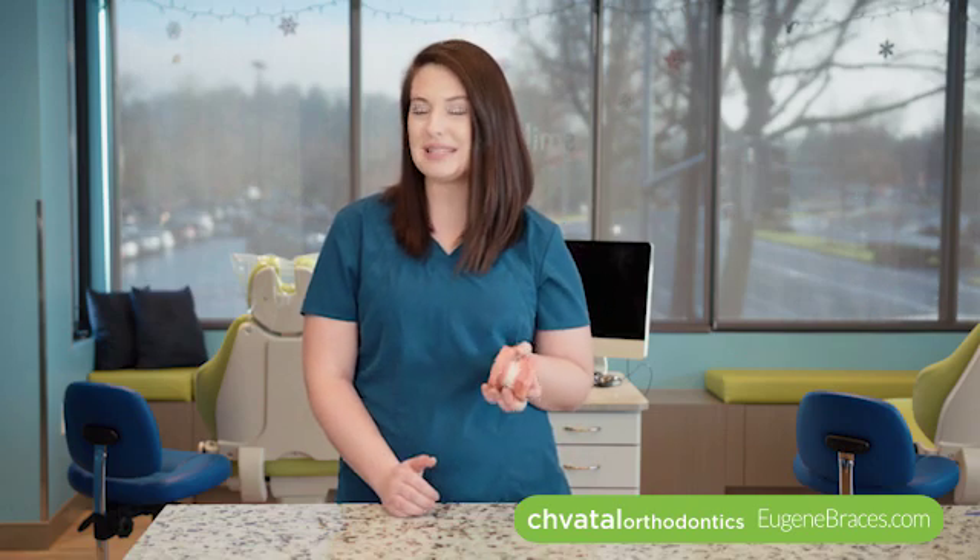Hi guys, I'm Kelly. I'm one of the orthodontic assistants here at Chavital Orthodontics and today I'm going to talk to you about the Herbst appliance. I just want to go over some of the parts that it has and some of the home care instructions that you'll need.